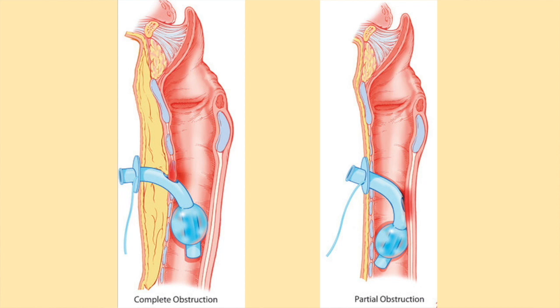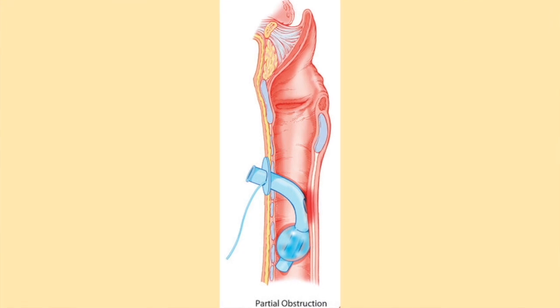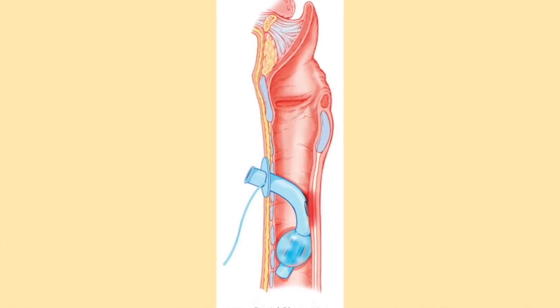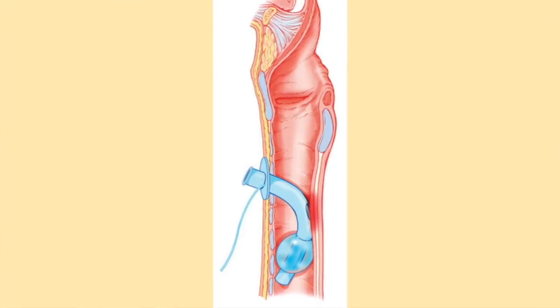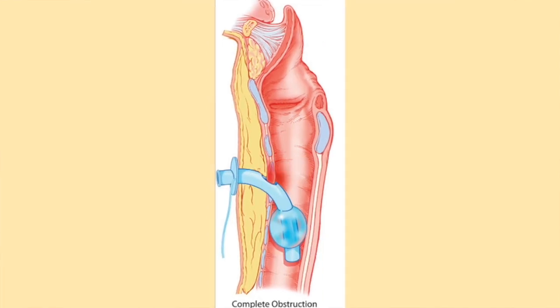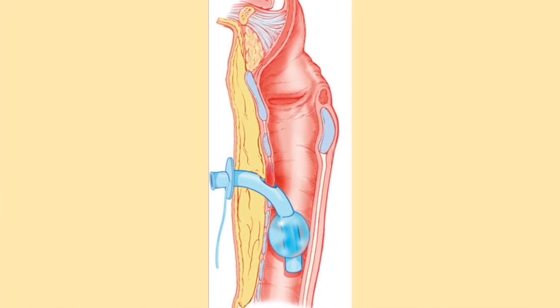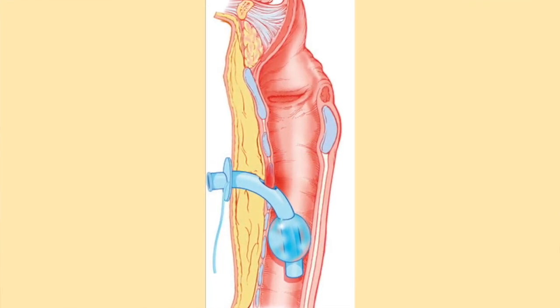Fenestrated tracheostomy tubes may not be properly positioned in the patient's airway. The fenestrations may come in contact with the tracheal wall. This can increase the risk of granulation tissue and compromise the airway. Granulation tissue has also been reported to have grown through the fenestrations. This requires emergency intervention to restore the airway.